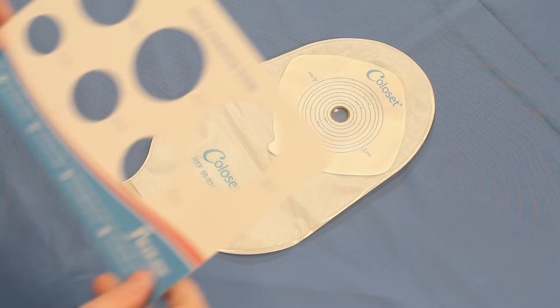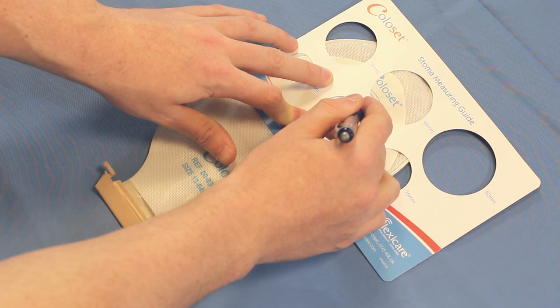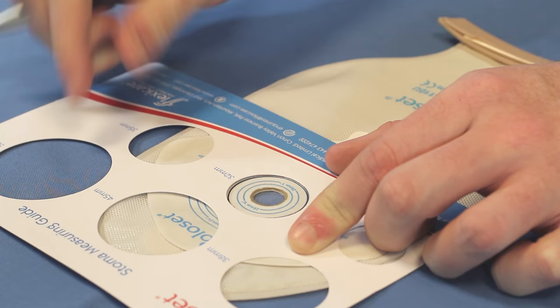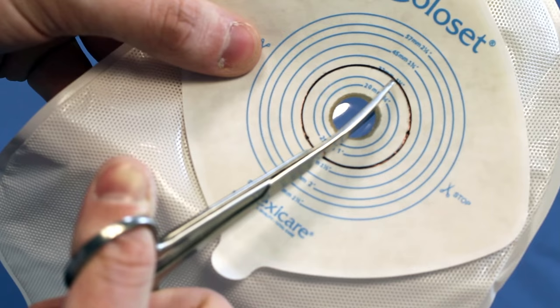The second step is to outline the size of the stoma. Place the guide as close to the center of the barrier as possible, using the rings as a guide. Mark and trace around the inside of the rings to the correct size of the stoma, then cut the barrier to that size.